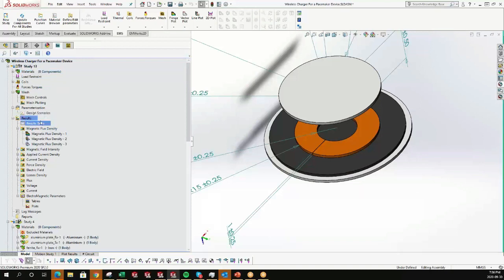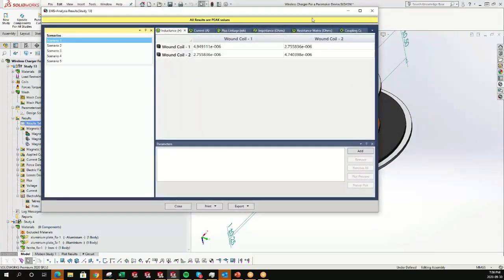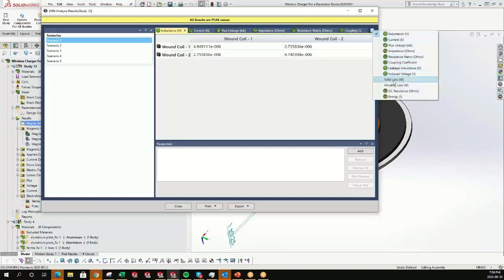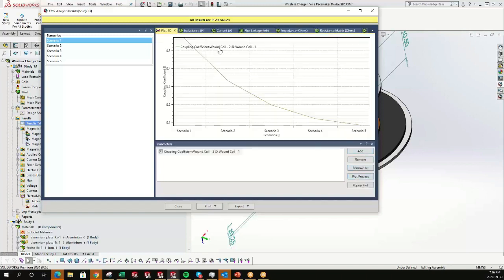So, the results section, the results table, contains inductance, current, flux linkage, impedance, resistance, coupling coefficient, and more results like losses and voltage and so on. Let's check the coupling coefficient. This is the coupling coefficient of the studied system. It is high when the air gap is small. This is when the air gap is 5 millimeters, and this is when the air gap is 20 millimeters, for example. It became smaller.